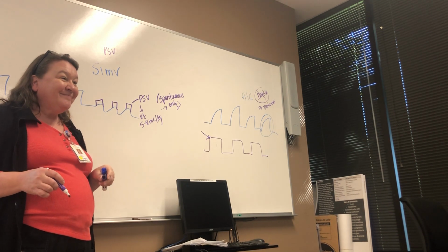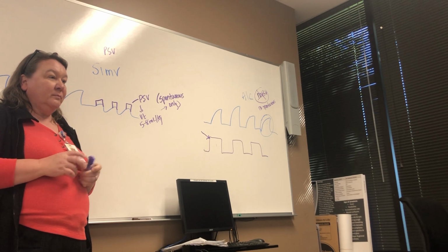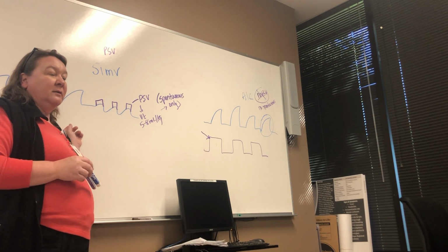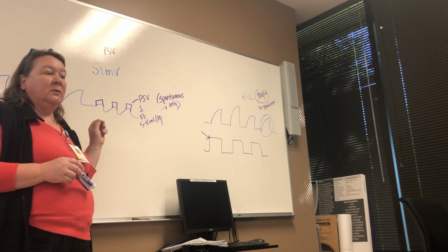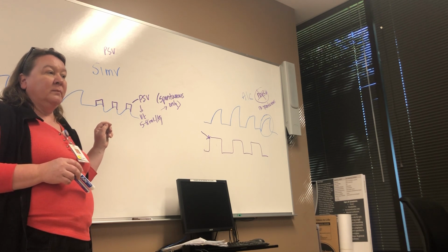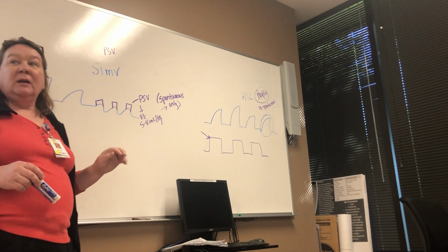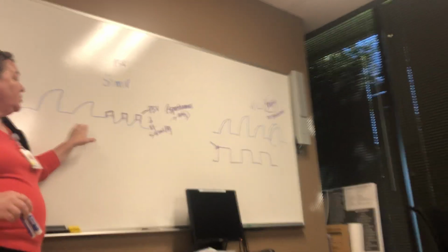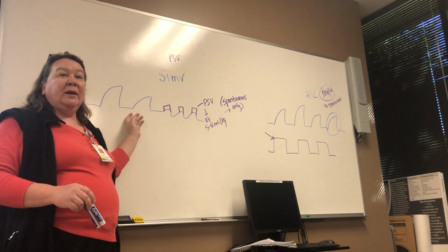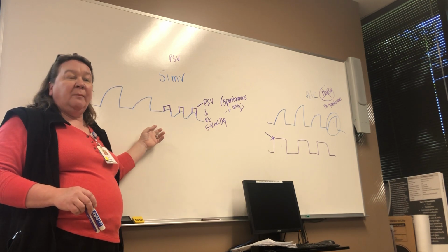Back a minute or two. You said pressure control is on mandatory breaths for AC or SIMV, it doesn't matter. So pressure control can be in anything, but pressure support is only in SIMV. Correct. So, because remember, once we get down to whether I'm going to be all mandatory or mandatory and spontaneous, what does volume control tell me about it?